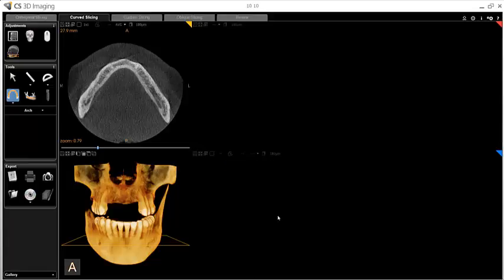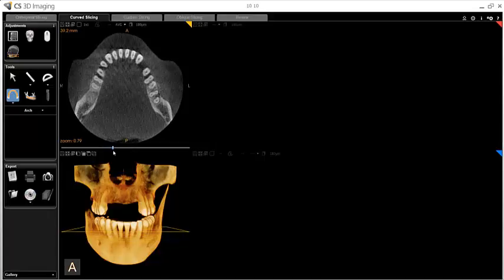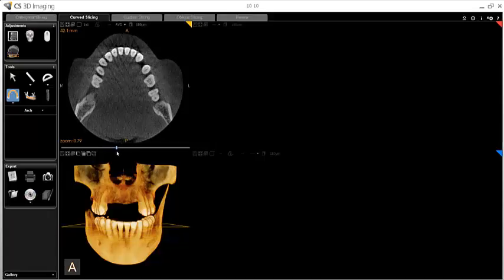On the curved slicing tab, adjust the axial view using the slider below the image until you find the level at which you would like to draw your panoramic curve. Generally, this will be done at the level of the crowns of the teeth, but if you're intending to focus on a different region — the maxillary sinuses or the mandibular nerves, for example — the axial slicing may be adjusted accordingly.